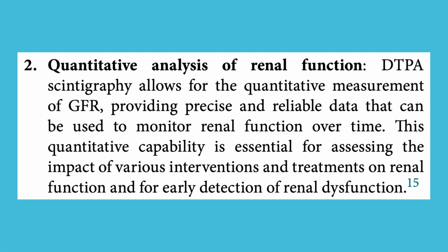2. Quantitative analysis of renal function. DTPA scintigraphy allows for the quantitative measurement of GFR, providing precise and reliable data that can be used to monitor renal function over time. This quantitative capability is essential for assessing the impact of various interventions and treatments on renal function and for early detection of renal dysfunction.